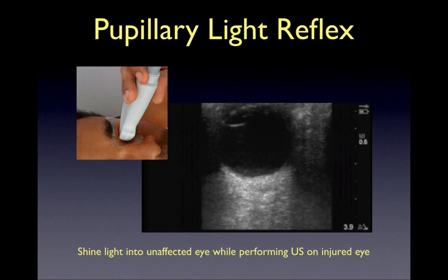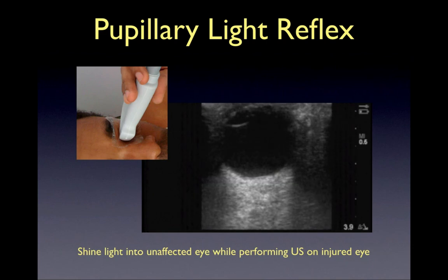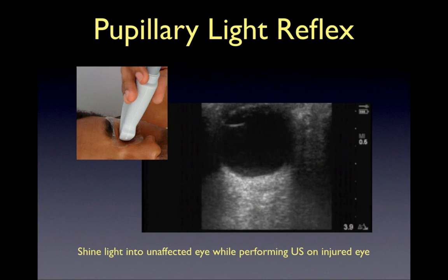Here, looking in this plane, it is subtle, but at the top of the video there, you can see the iris contracting and expanding and causing changes in the size of the pupil. So you can look at this in different planes, but generally the coronal one on the last slide is the one people use because it's the best way to visualize the pupil.